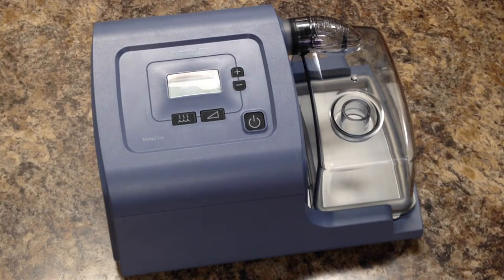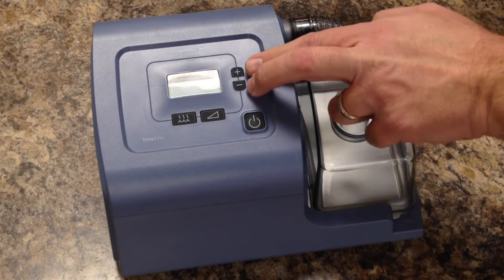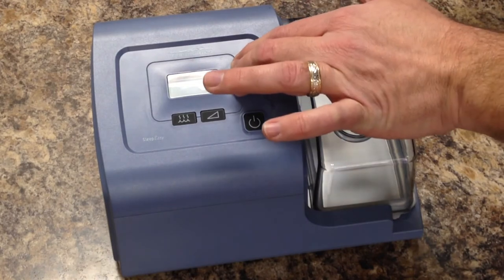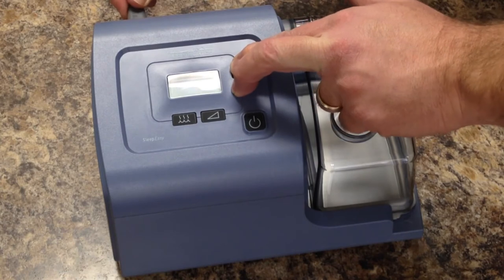To check the run hours on a Respironics Sleep Easy device, you will need to hold the power cord in one hand, and before plugging it in, you need to press and hold both the minus and the plus button. You need to hold both of those buttons down, and while holding those two buttons, you're going to plug the machine in.